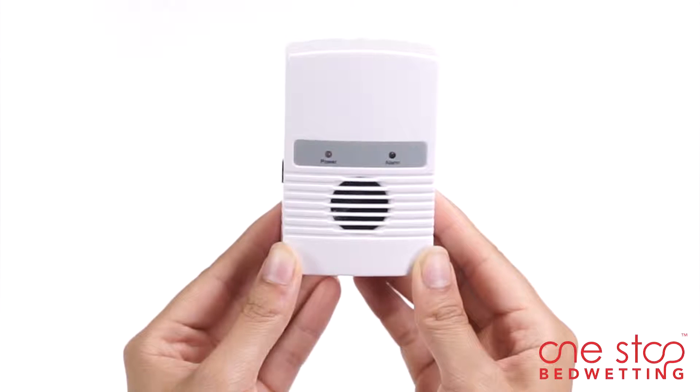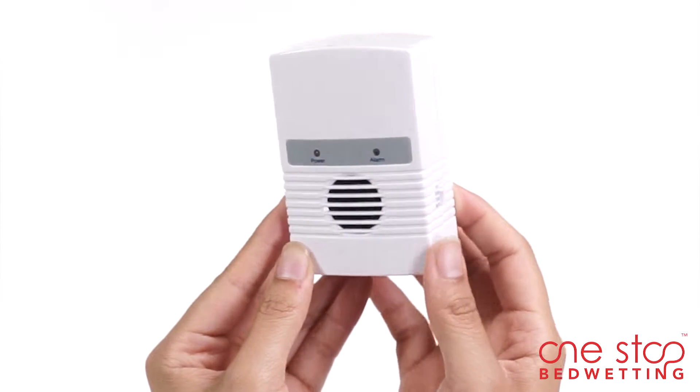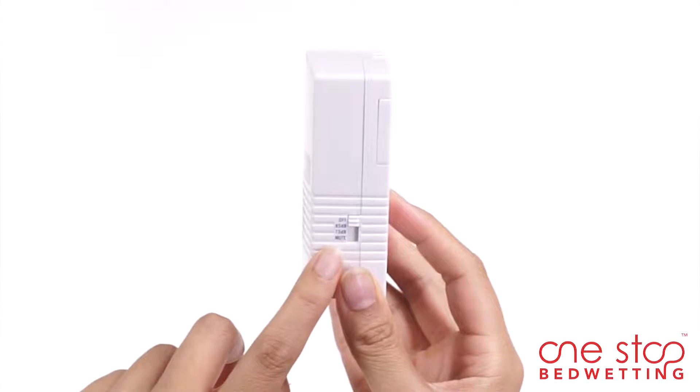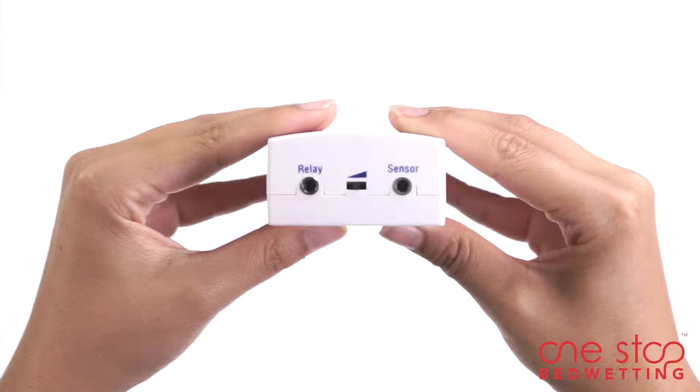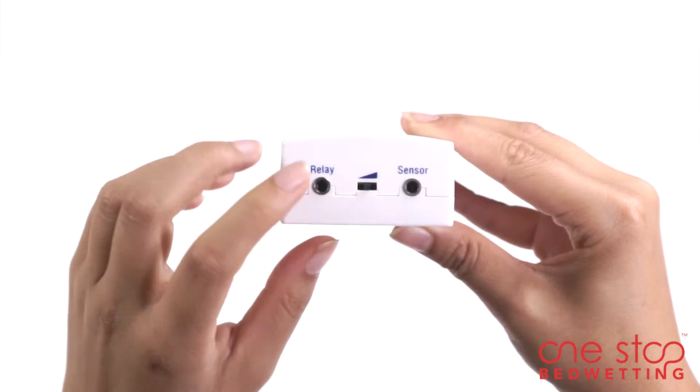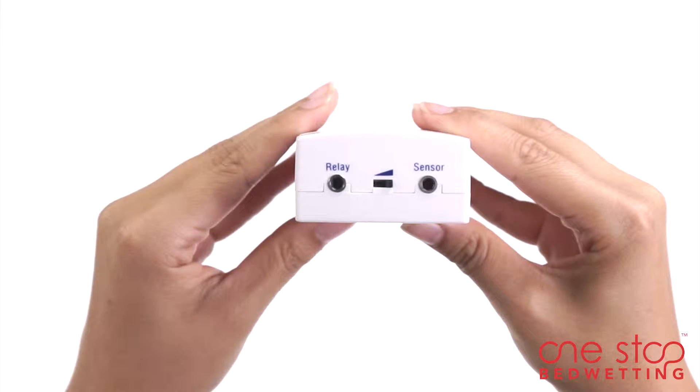Boost can be easily programmed with the 4-in-1 control switch that allows you to turn the alarm on or off, choose the volume levels, or set the alarm to mute. Once a desired selection is made, set the extension button to the sensor setting.